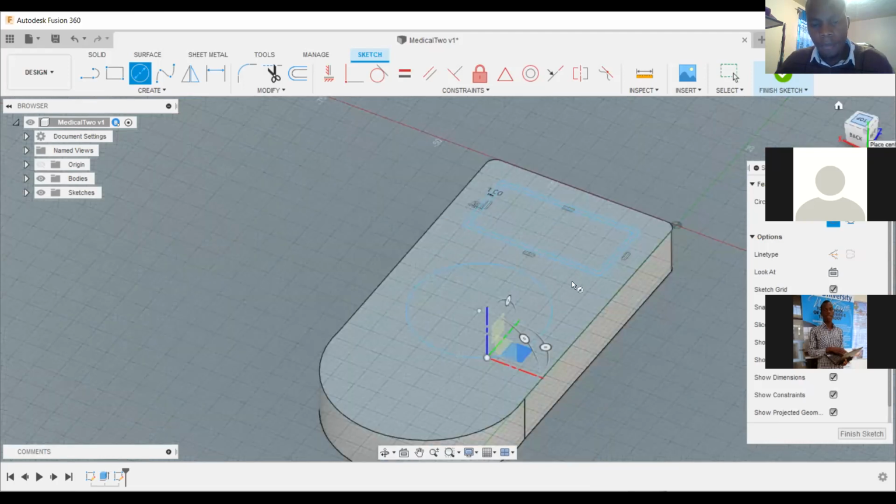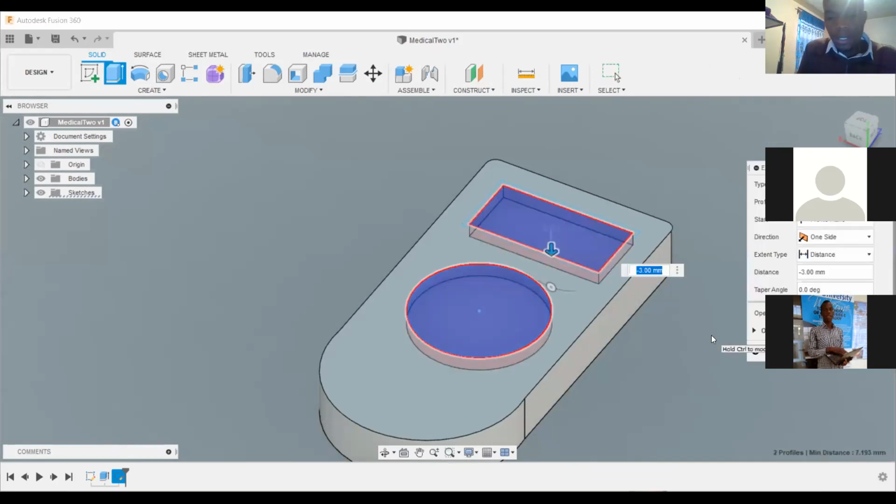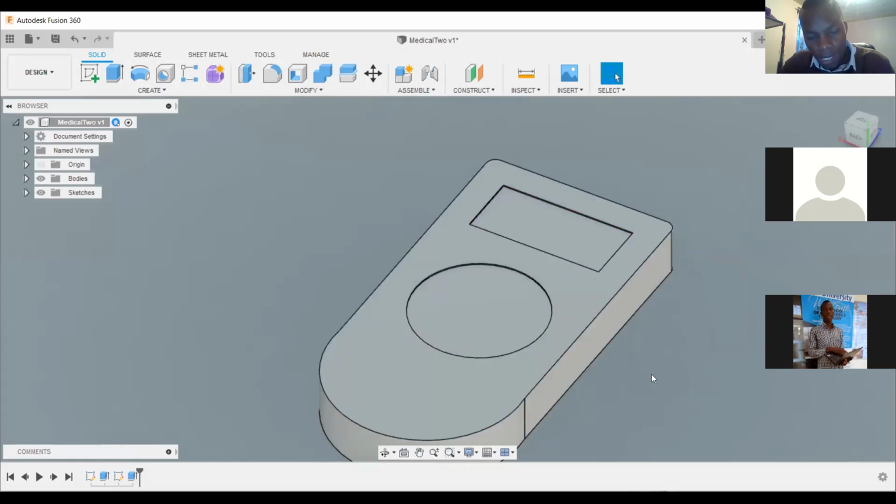So I've drawn a circle here. Then click finish. Then we are going to extrude this inward with negative 0.25. It has gone in a very little bit.